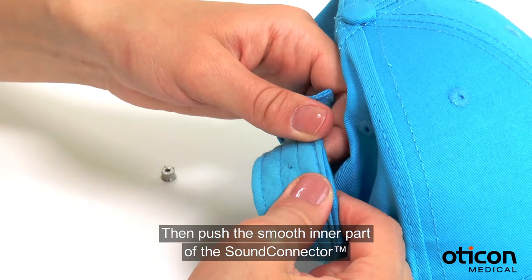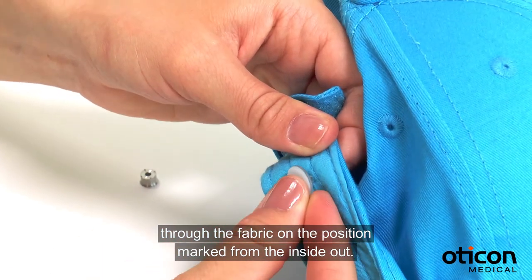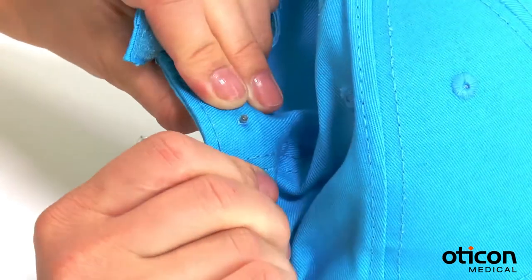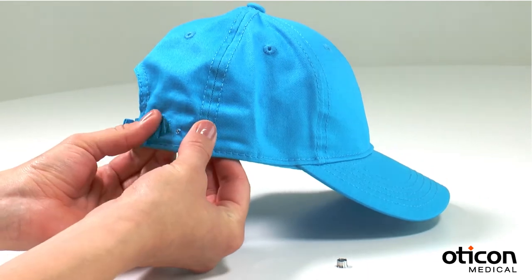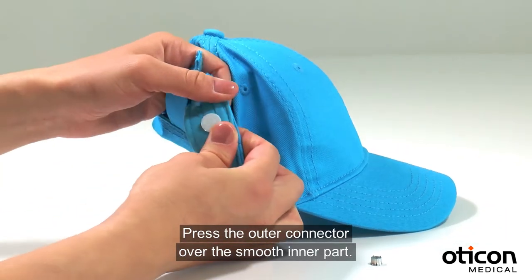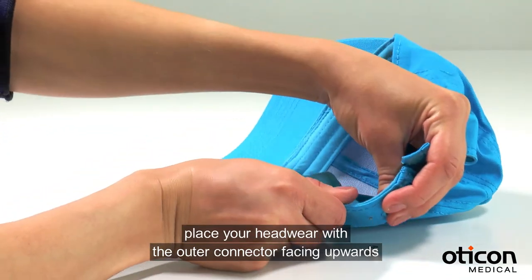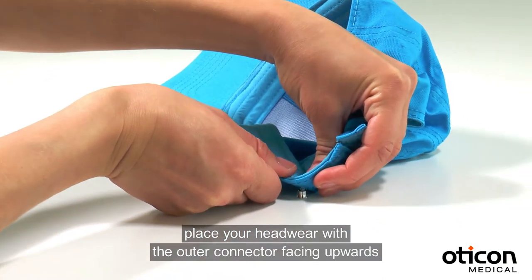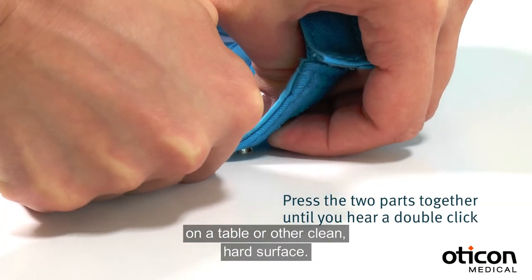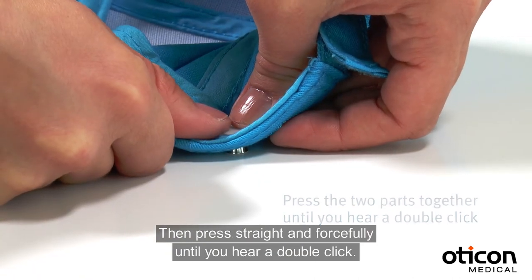Then push the smooth inner part of the sound connector through the fabric on the position marked, from the inside out. Press the outer connector over the smooth inner part. Once the two parts have been lined up, place your headwear with the outer connector facing upwards on a table or other clean hard surface. Then press straight and forcefully until you hear a double click.